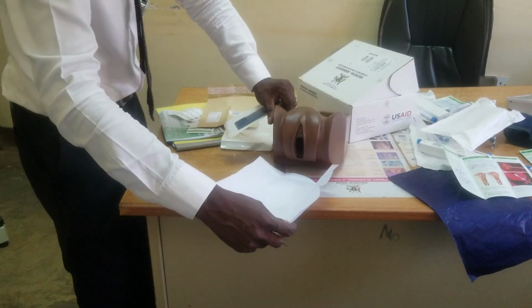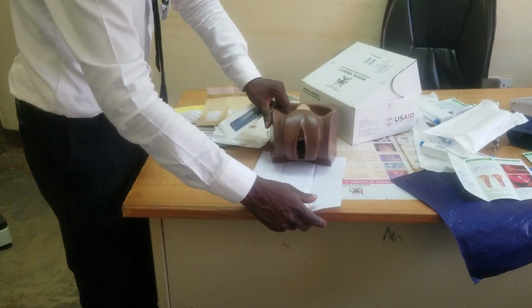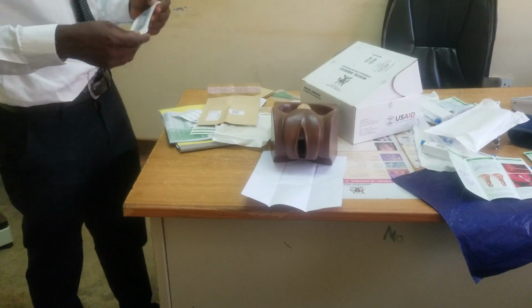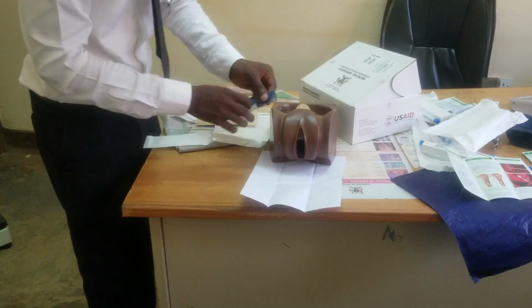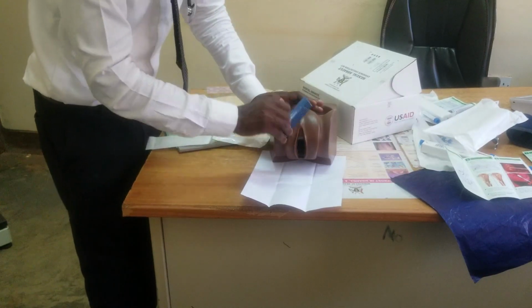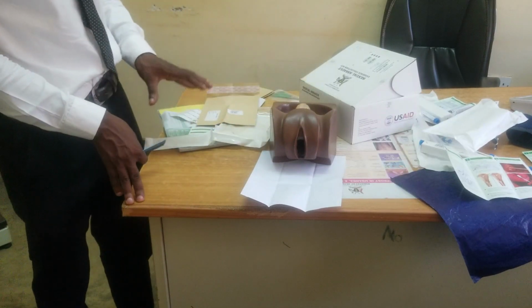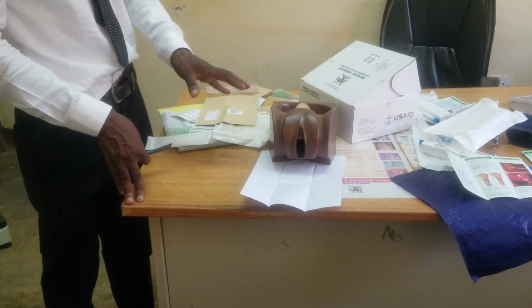Then there is what we call foreign debris. You make her raise up a bit. You place the white paper below. Then you comb. You will see that some pubic hair or other foreign debris will fall off.